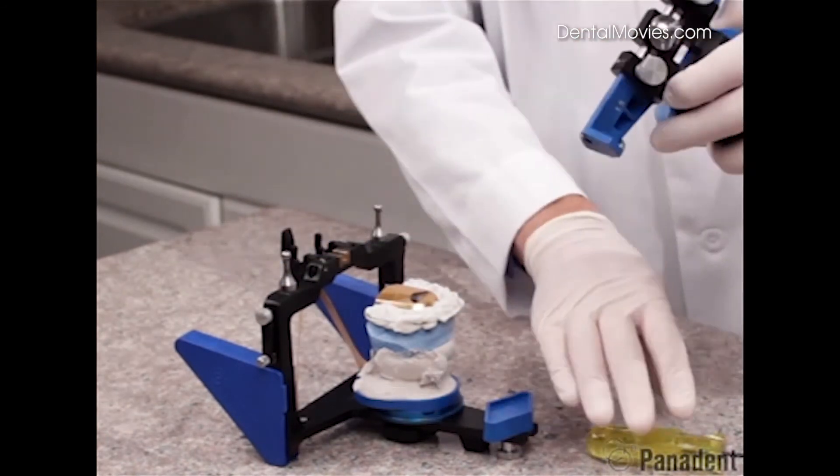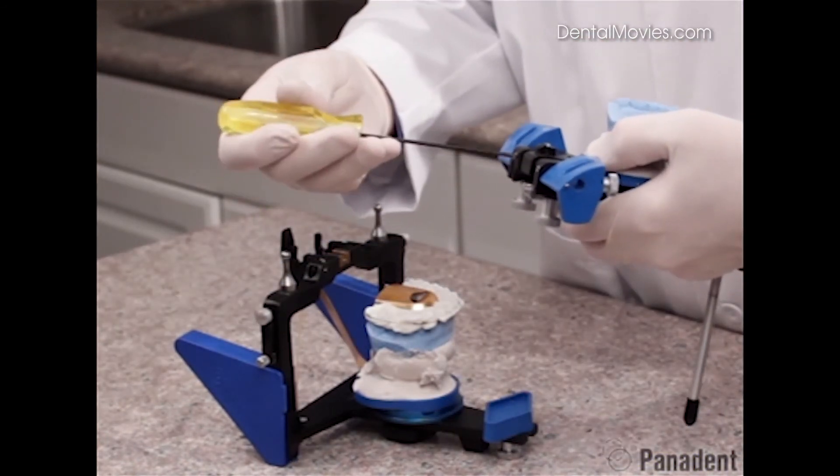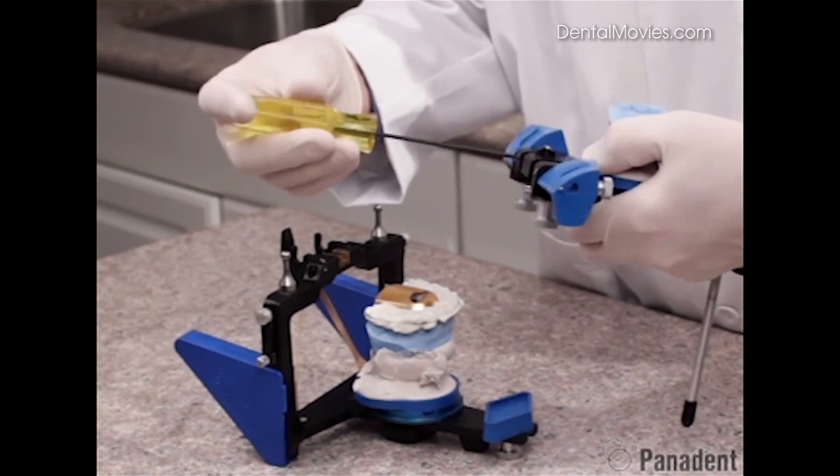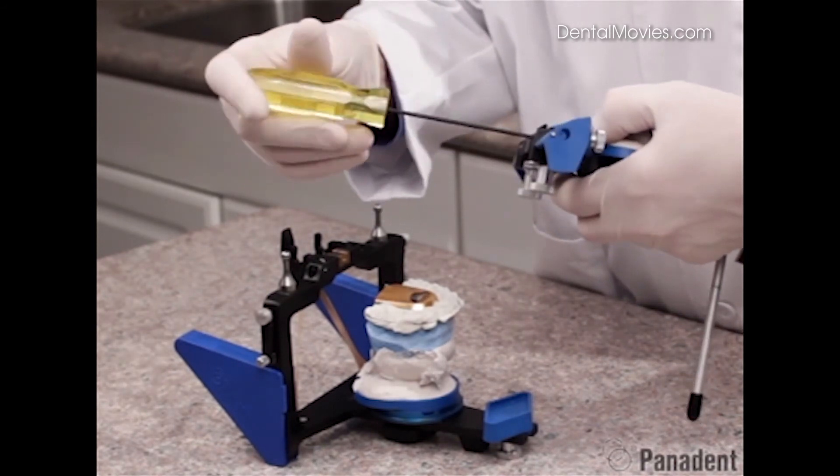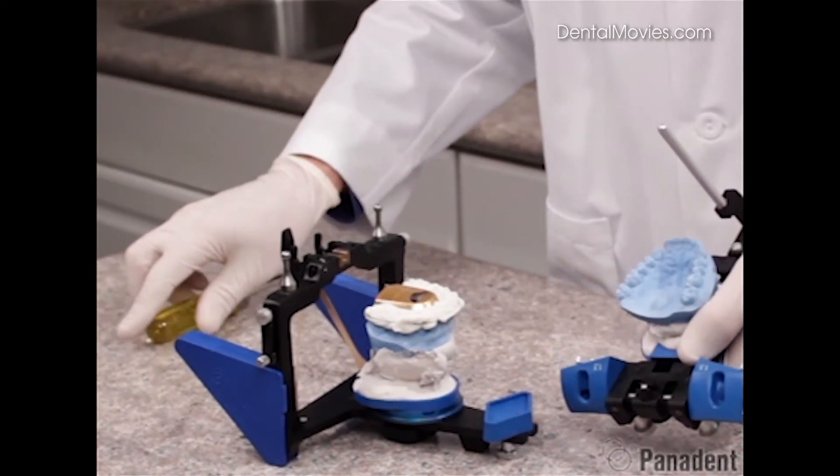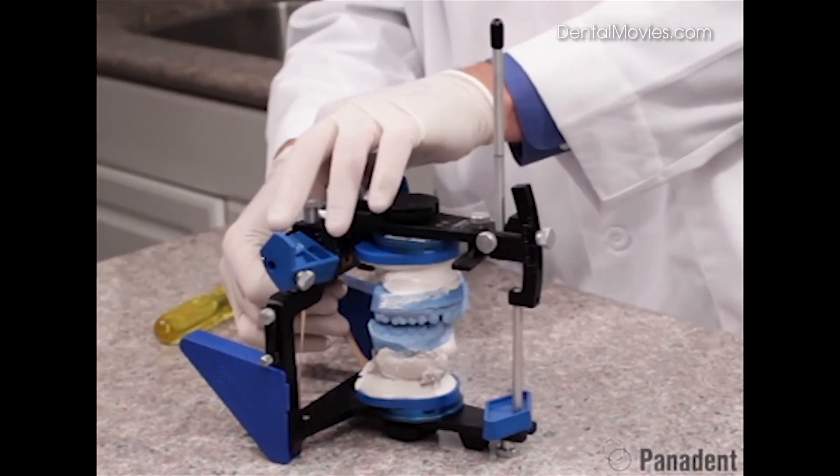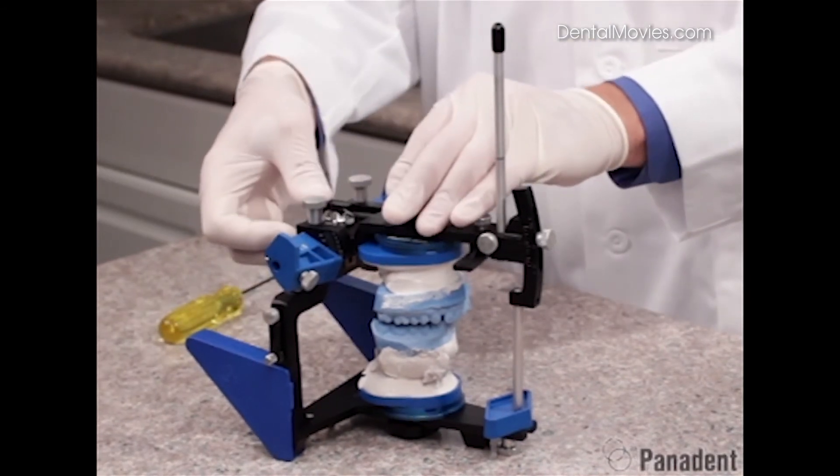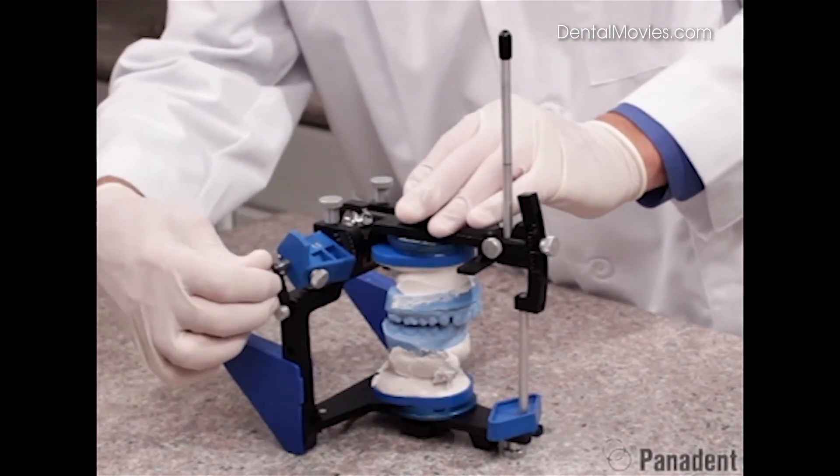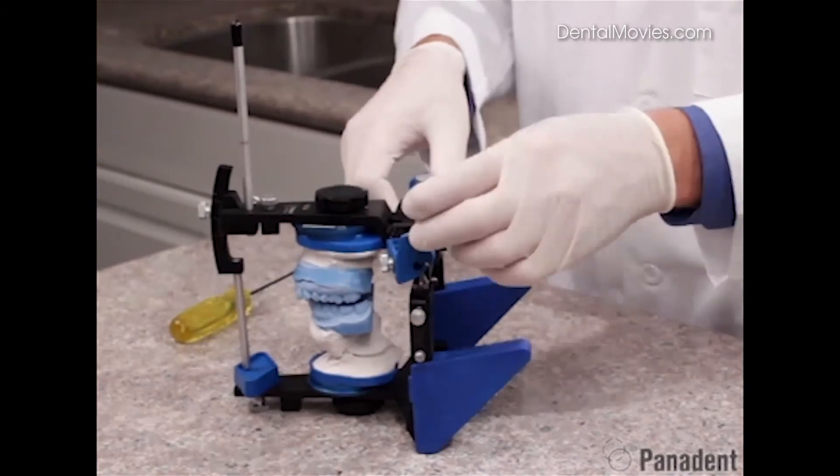We can now remove the upper frame and go ahead and lock these lock screws in the back, locking that position of the motion analogs. We can then remove the protrusive record and add back the upper frame to the articulator. We can release the rubber band here in the back, re-engage the centric latch, and re-engage the Dynalink pins back into the motion analog.